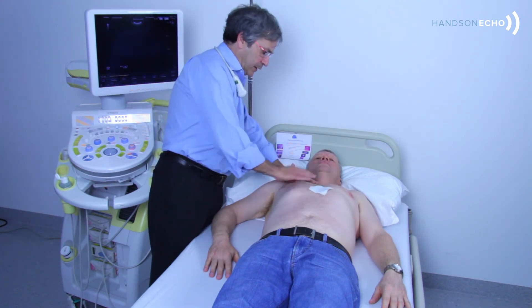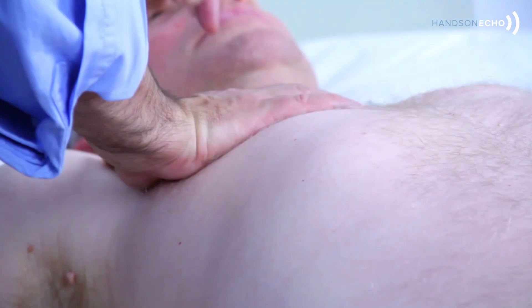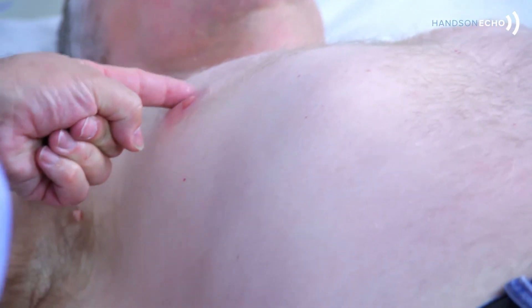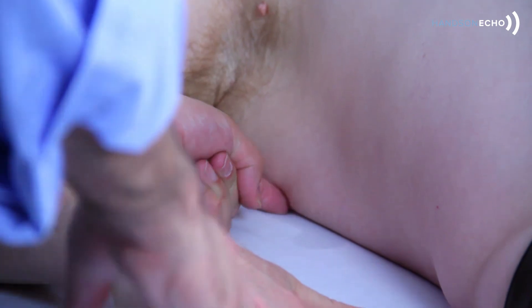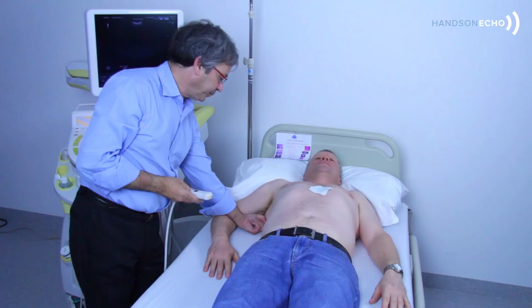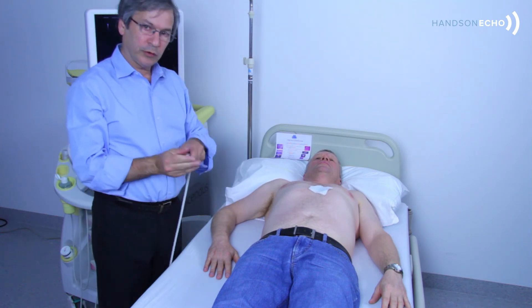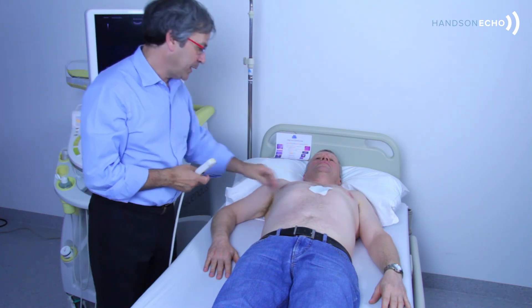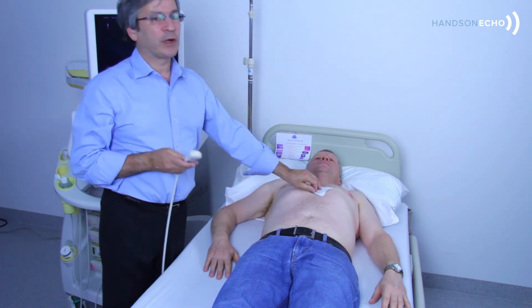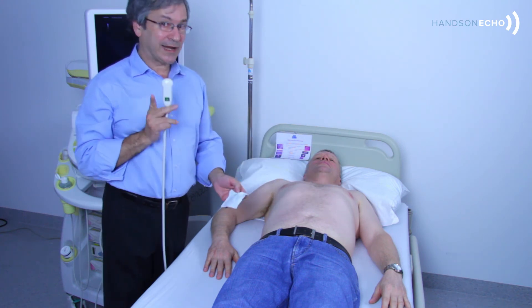You remember the lower blue point was here, and we just continue transversally from the lower blue point and will put our probe exactly here. The more the probe is short, the easier you come posteriorly and the easier you can compare your lung scanning with CAT scan.